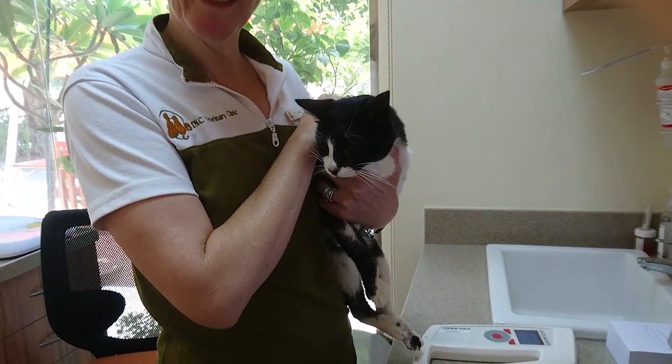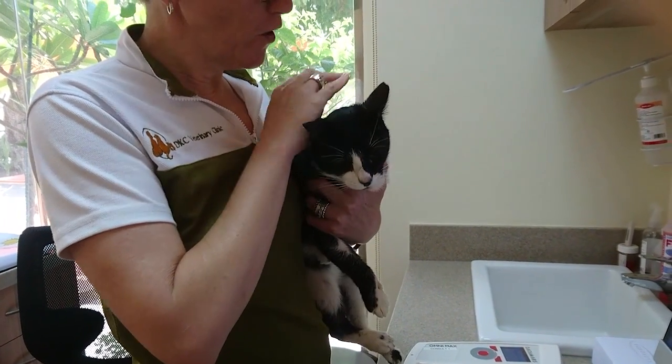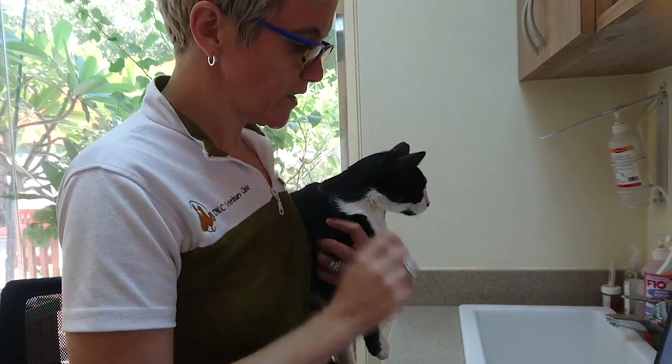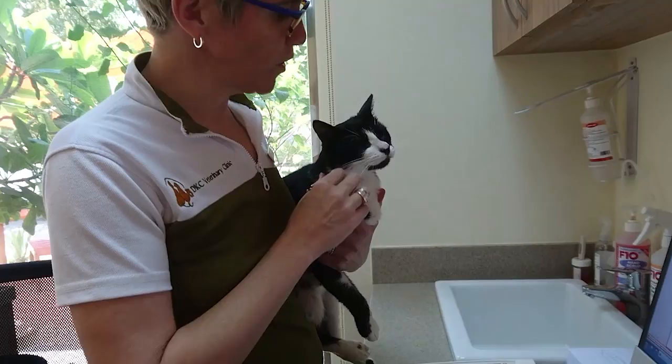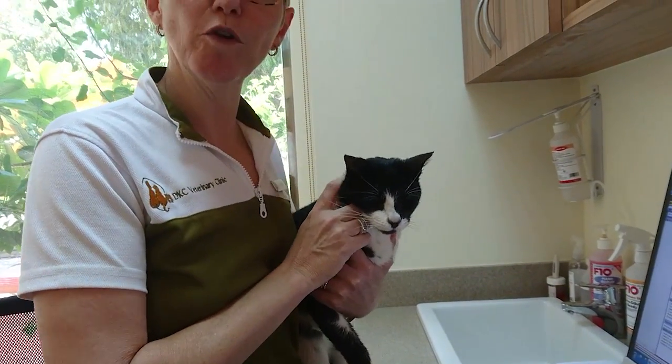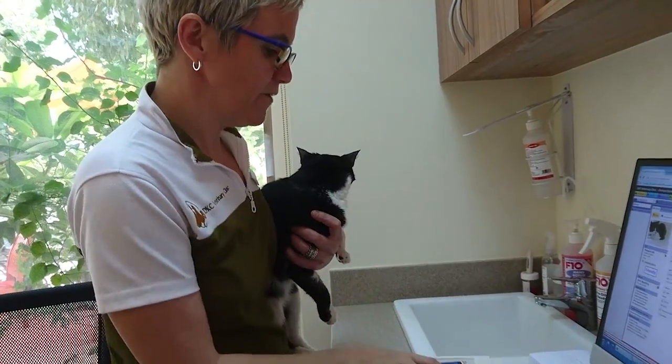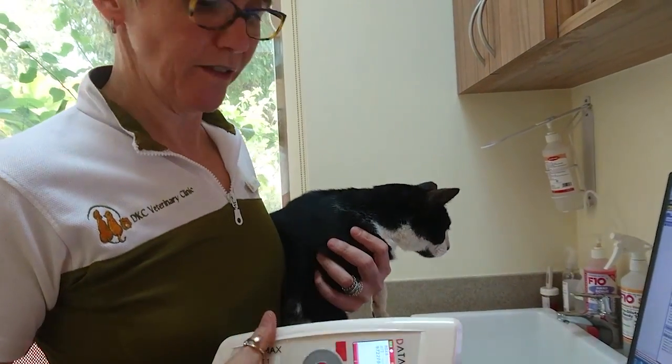Today we've got a little penguin here and we're going to be showing you — it doesn't sound very exciting, but I think it's quite exciting — how we scan microchip numbers. Microchips are little identification tags, I'm sure most of you are aware, that has a long number that basically identifies the pet.